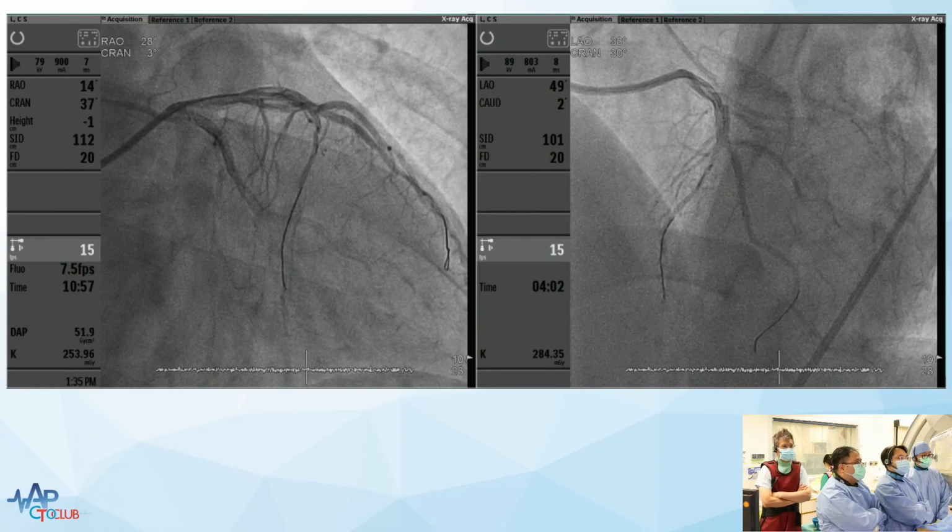Because if you try retrograde wiring here, I'm just concerned the diagonal's big. So I guess you could do direct crossing under IVUS guidance. Yeah, that's one. This is a very simple technique, simple procedure. Which is probably the safest way of doing it, but it'd be very important to confirm with IVUS that you're coming true to true with two fairly significant branches.